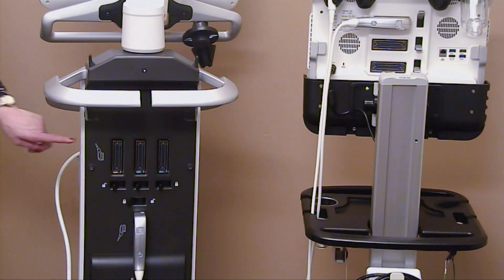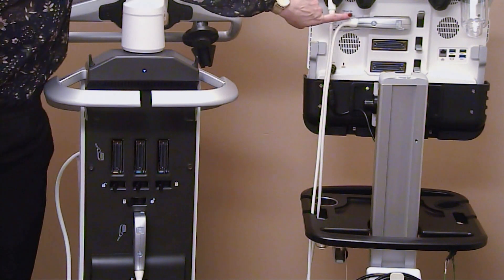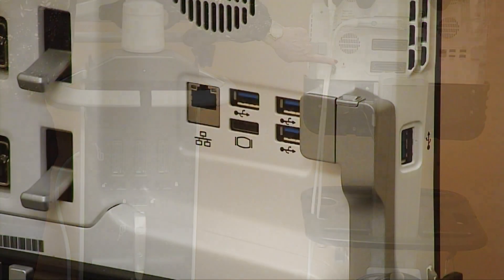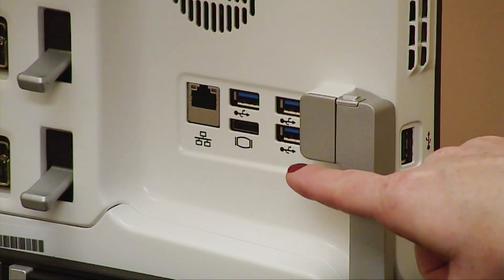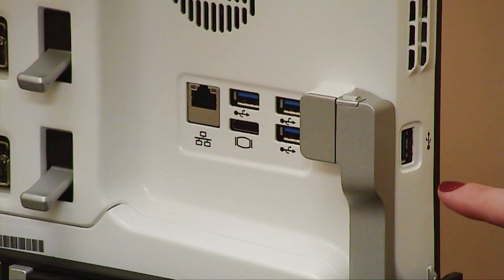The Venue has 4 probe ports and the VenueGo has 3 probe ports on the back of the system. On the back of the VenueGo, there is an Ethernet port, an HDMI port, and 3 USB ports — two are seen here and there is one on the side.